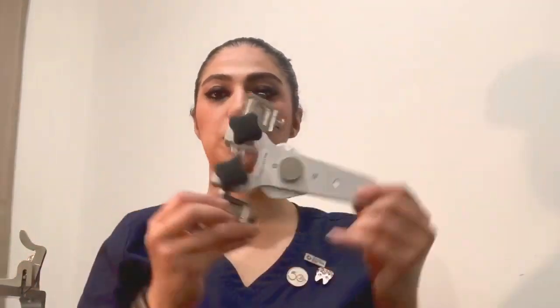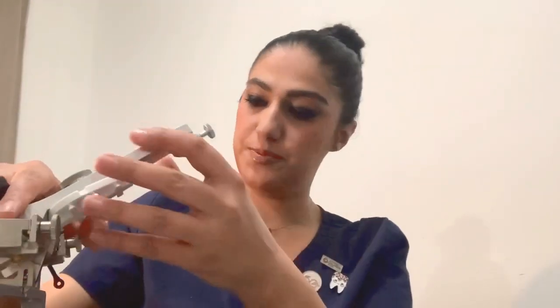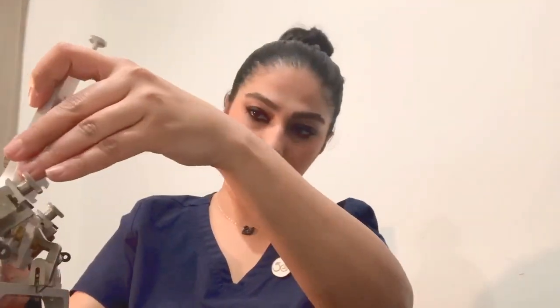This is the upper part of the articulator. The upper part of the articulator is the analog of the patient's maxilla, so the upper part sits on top of the lower part. As you can see, there is a centric lock, and you can lock the lower part with the upper part of the articulator using the centric lock.